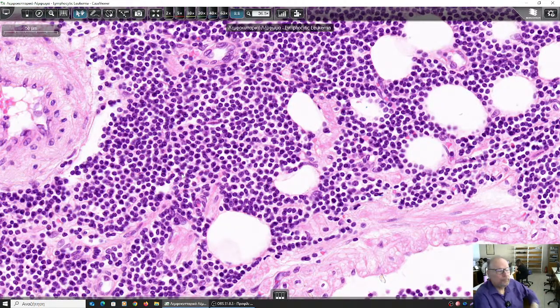All right. And now we have a low grade, because it is evident that it is low grade, since the lymphomatous cells are too mature looking, deceptively benign looking. This is small lymphocytic lymphoma, a low-grade B-cell lymphoma, which when these cells circulate in the blood is compatible with chronic lymphocytic leukemia, because if we have malignant cells circulating in the blood, we diagnose leukemia.